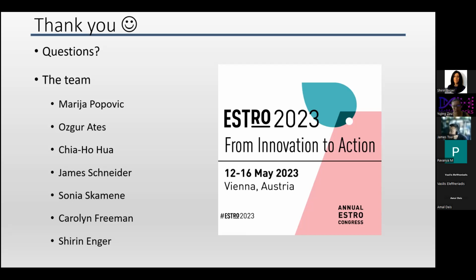Sami Bahig is here to answer Hamid's question. Hamid Jamal asked about the double or cross-check, the near-miss instinct: what about the model implemented after perfect validation and FDA approval? What tool may be used as a double check? Oh, he's still human. At the end of the day, every plan that goes out, every plan that gets treated, I sign it. And should anything happen to the patient, I'm responsible. So you can rest assured that I will always check all my plans, regardless of whether it was a human, a model, a resident, or the dosimetrist who did it. I check. Even before it gets to me, there are multiple QAs that are done. Different automated methods are being implemented right now. I sit on a committee that is looking at different ways of automating the check. But at the end of the day, I am responsible for the patient, so for sure, I will always check.